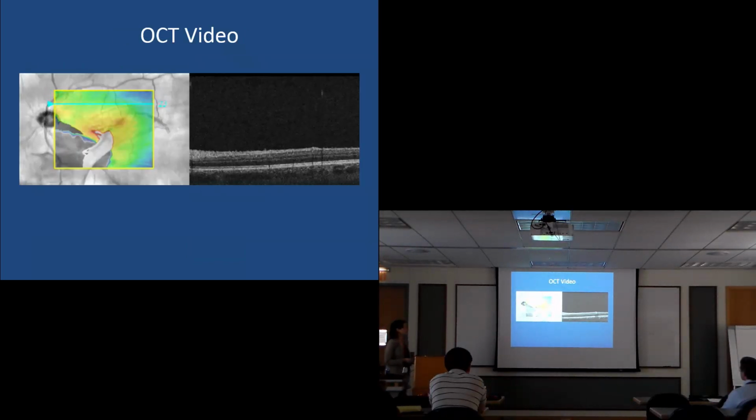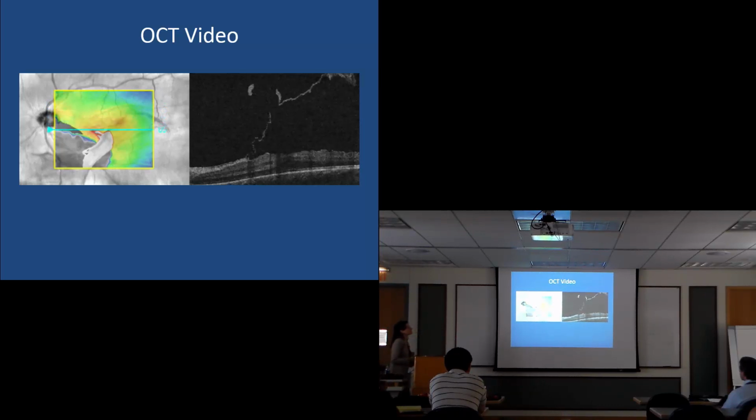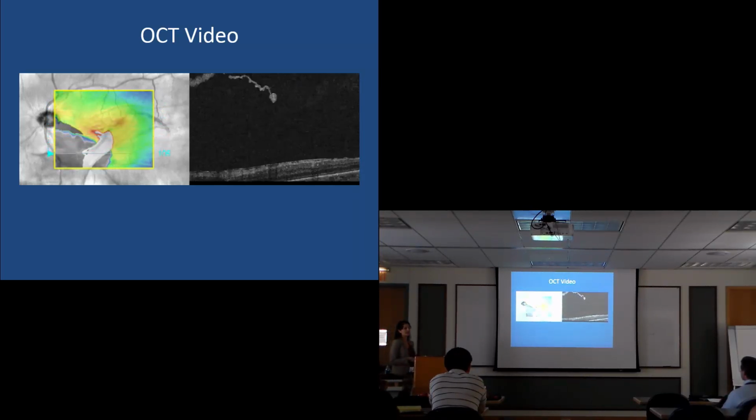This is neat because this is a video, so not only does this help to plan surgically, so if I was a surgeon wanting to remove that epiretinal membrane, which is the treatment, I can see exactly where it is. They use stains once they go into the eye, grab that tissue and pull it. Now we're also using OCT to find all of the surgical complications that sometimes when people pull epiretinal membranes, they actually pull the retina with it.